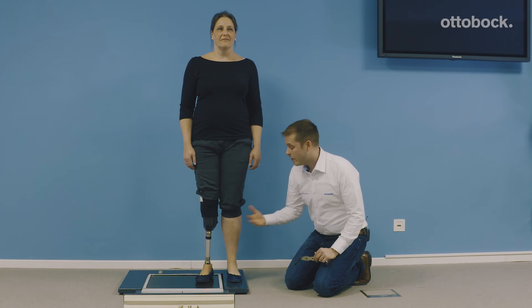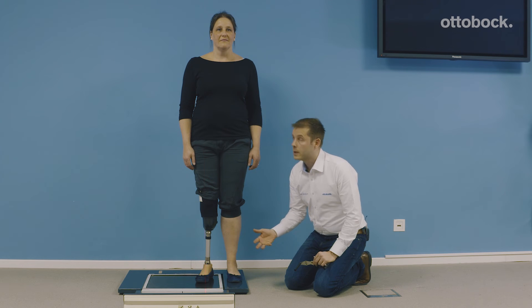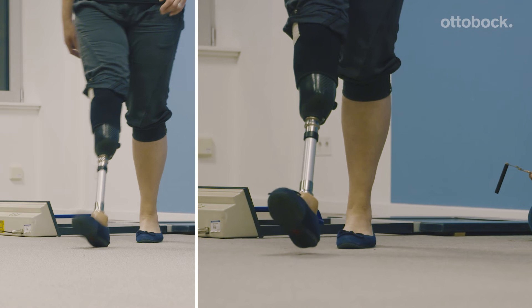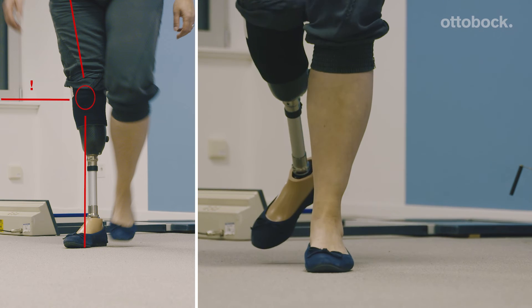If you would exceed the 5 degrees of external rotation, you can see a different effect in the gait pattern. We can see the instability and also extra stress on the body of the user — something that you really don't want to have for their health.